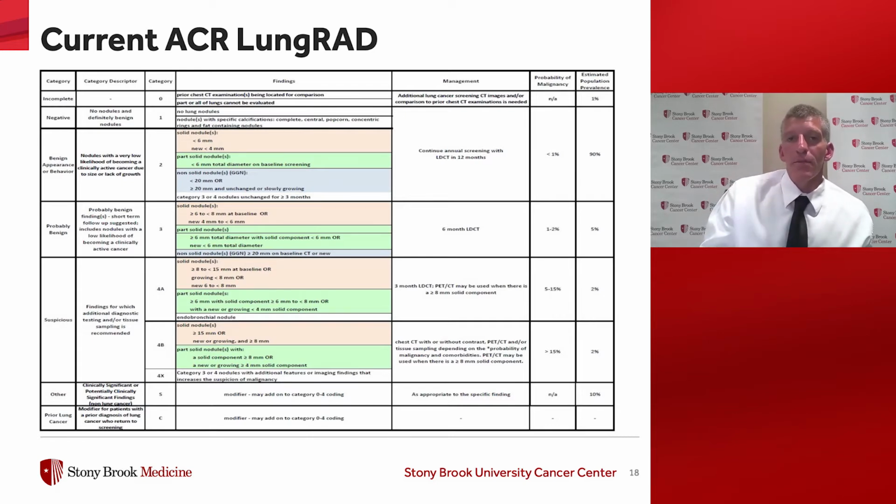So I think everyone is familiar. Mammography has been around for such a long time now. I think most people are familiar with BI-RADS. Right, there's no question as to what it is. So I think the goal has been to take that and apply it here. And there's a few other parts. Some of you get thyroid ultrasounds, there's TI-RADS now, and there's PI-RADS for prostate MRI, as an attempt to standardize the reporting so that there's less ambiguity of the reads between different radiologists, and that there's a more systematic approach to what to do with a finding.